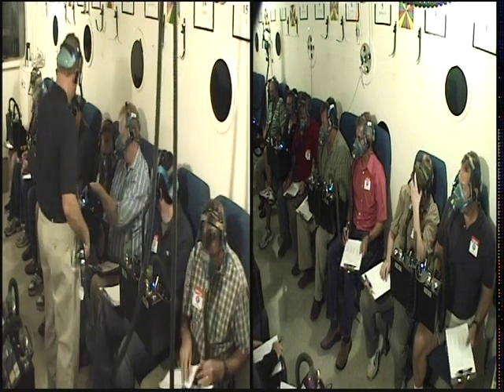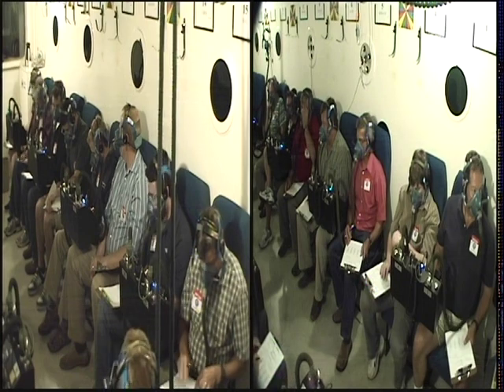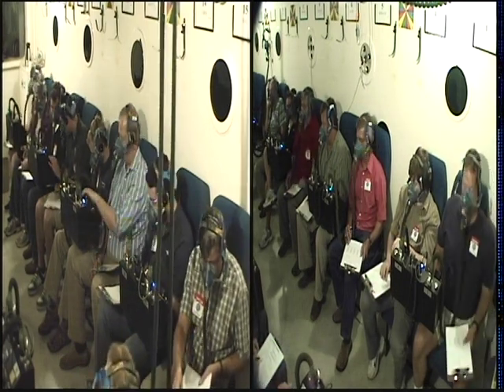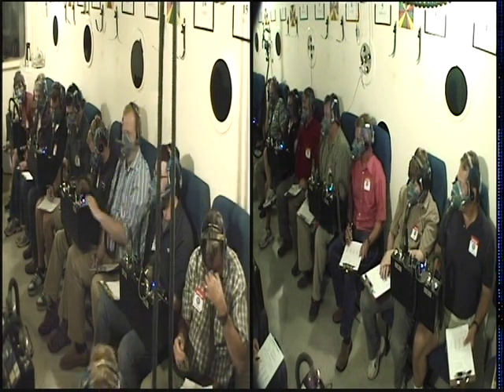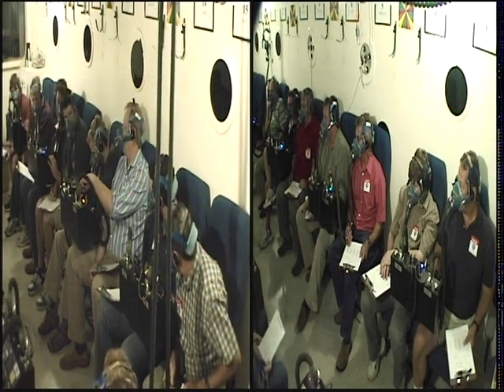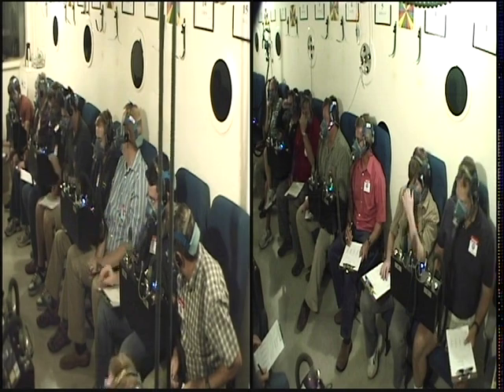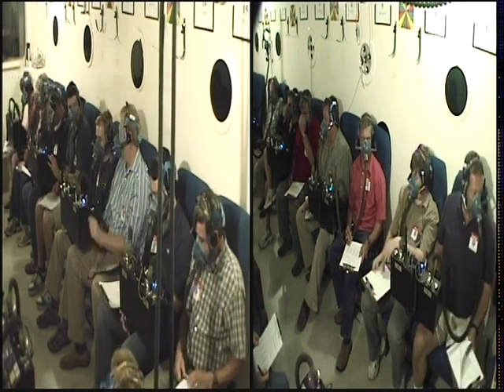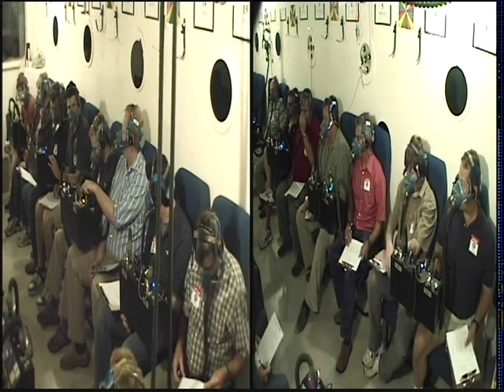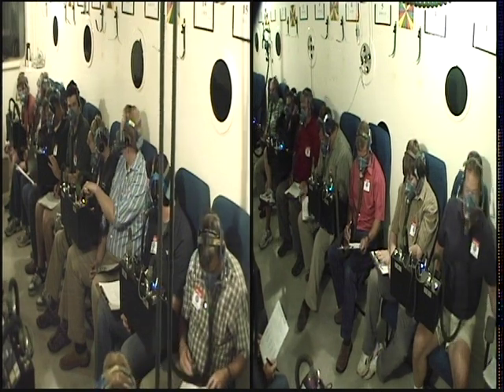What is that number significant of? Heck if I know. I asked you to count backwards from 100 by 3s, and you counted back, and you actually wrote that yourself. Yeah, he wrote 3 numbers and then circled all 3 of them. Okay, very good. Karsten, who put your mask on? Once again, I have no idea. Do you think maybe you did? I doubt it. Do you have any recollection of what happened? Truthfully, I looked at the pulse ox. It was 63, and after that, not a clue. And until when? Oh, until Eric.